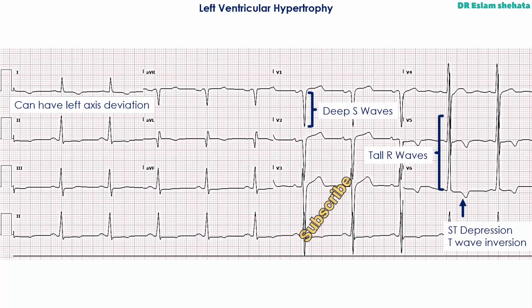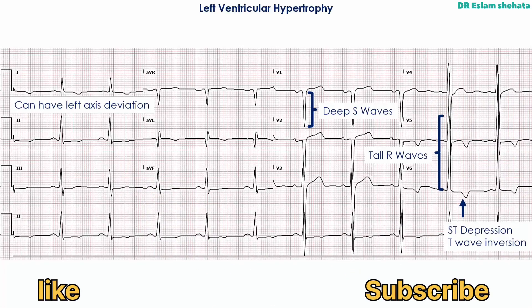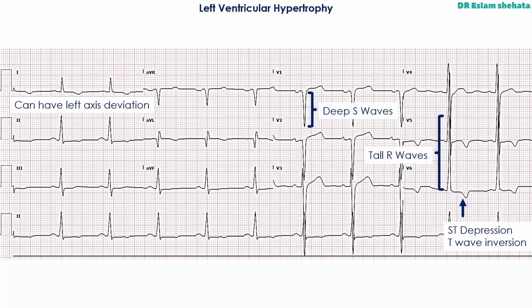So this is left ventricular hypertrophy. The most obvious finding is these QRS complexes are pretty big. As you can see, V6 extends all the way up — it ends up here, that's the top of our QRS complex, halfway into V5's territory.